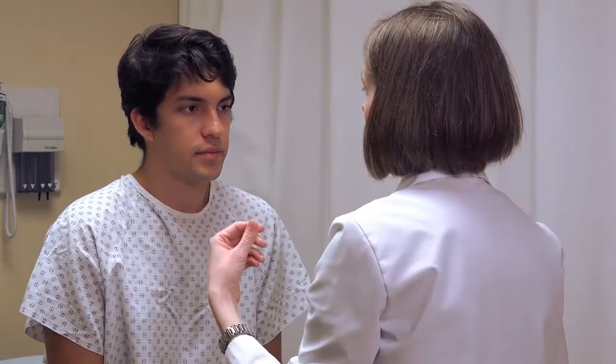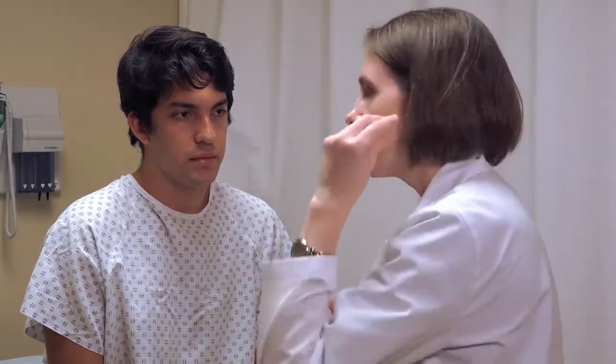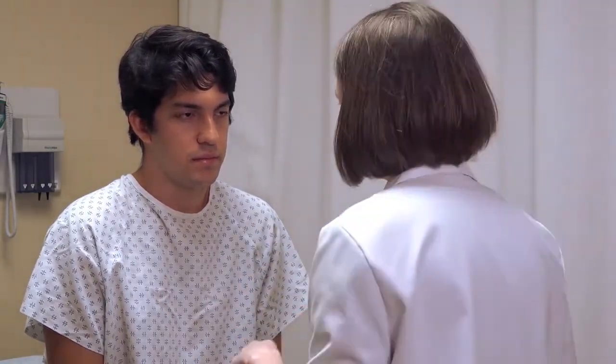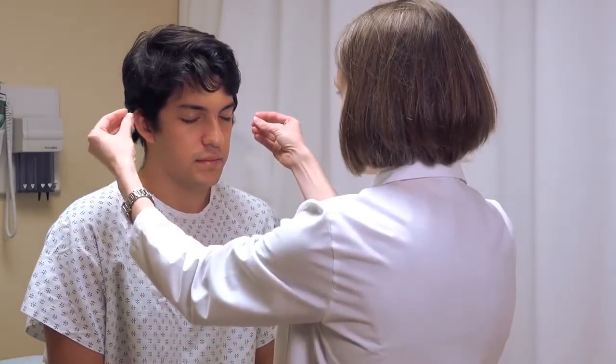For the finger rub hearing screen, rub your finger next to the patient's ear on both sides and ask which ear they hear it from. Before doing this, rub your fingers next to your own ear to make sure you're producing a sound — if your hands are damp from lotion, there may not be enough friction. Ask the patient to close their eyes and tell you which side they're hearing it on.